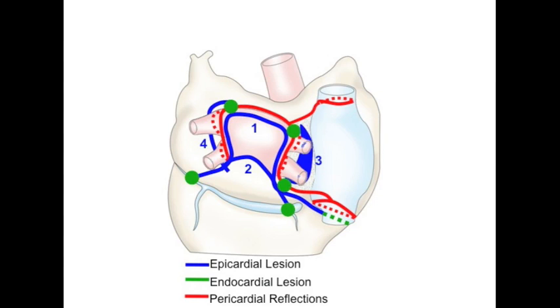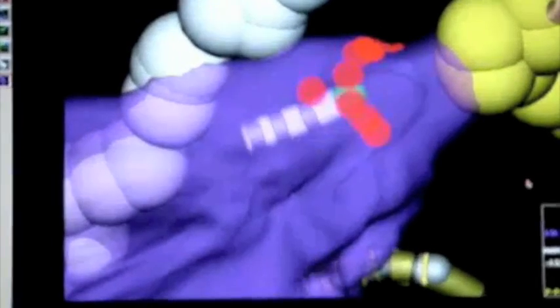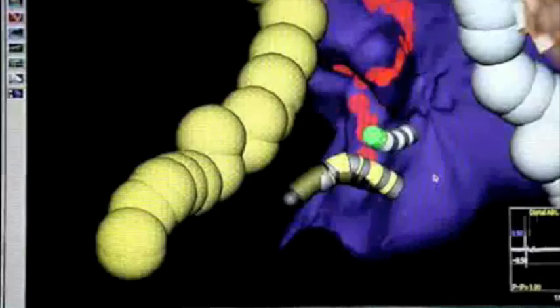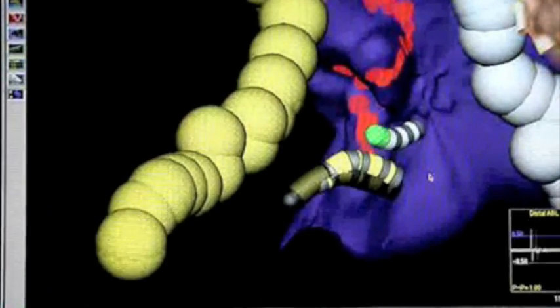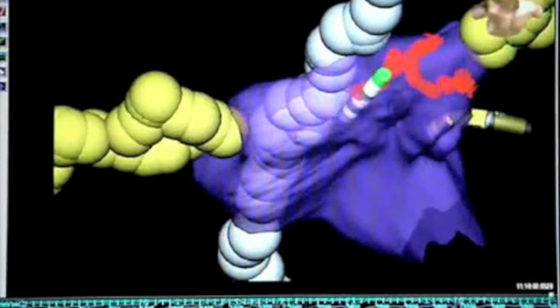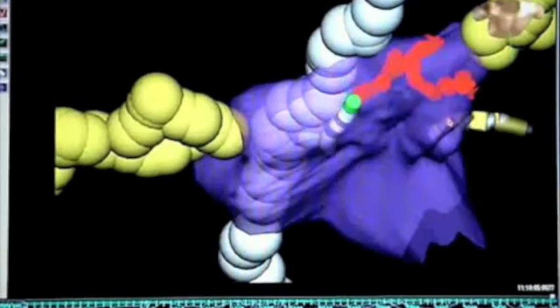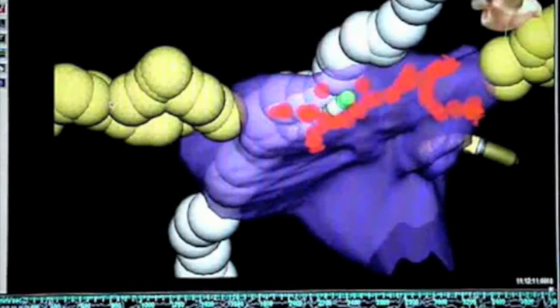There remain areas of the heart that are not reached with this procedure. These require an endovascular approach performed immediately following the epicardial approach. An electrophysiologist utilizing standard electrophysiologic tools goes about making a series of burns within the heart, completing the process.